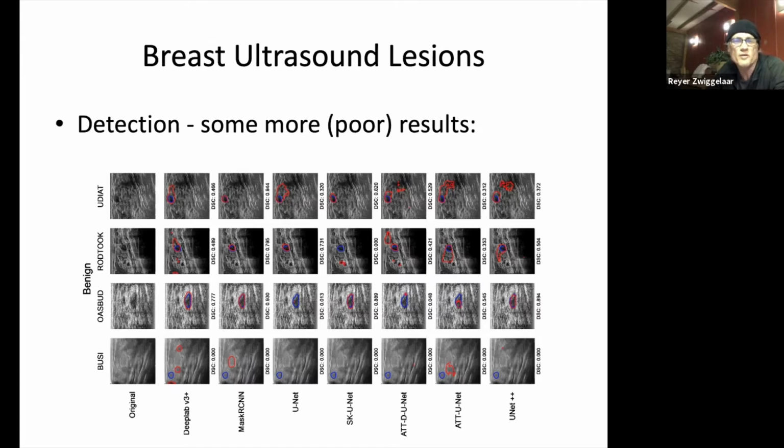What we've found since we've been doing this work is that some of the deep neural networks are very preferential for the size of the abnormality. Clearly that has something to do with the data you're feeding into a deep neural network. If it has lots of examples of large lesions, then it has a preference to detect large lesions. And in this case, for the very small lesions, where there are fewer examples, it performs poorly.